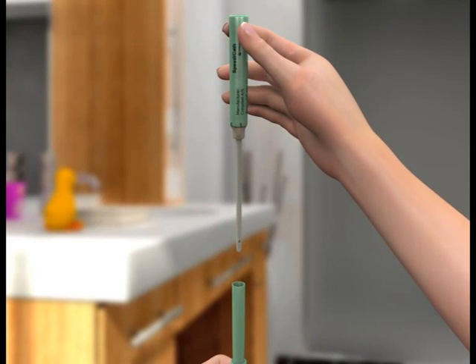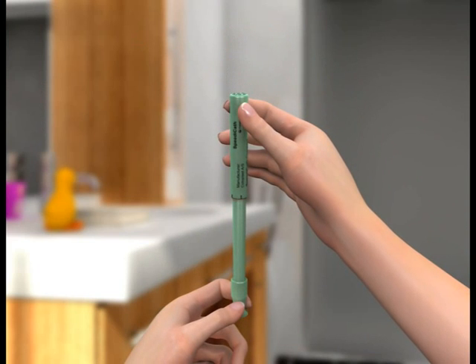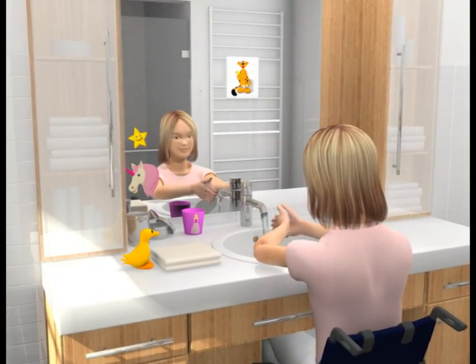When you're finished, throw the catheter and the packaging into your household rubbish bin. Do not flush it down the toilet. Wash your hands and it'll be time to play.